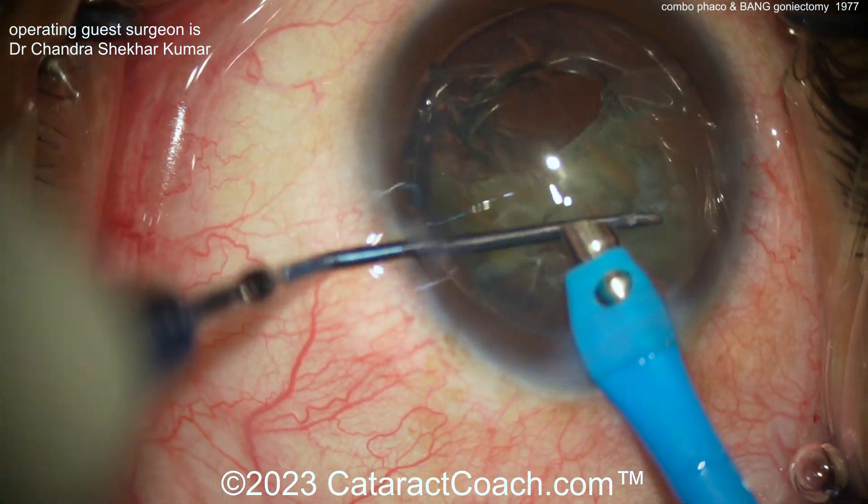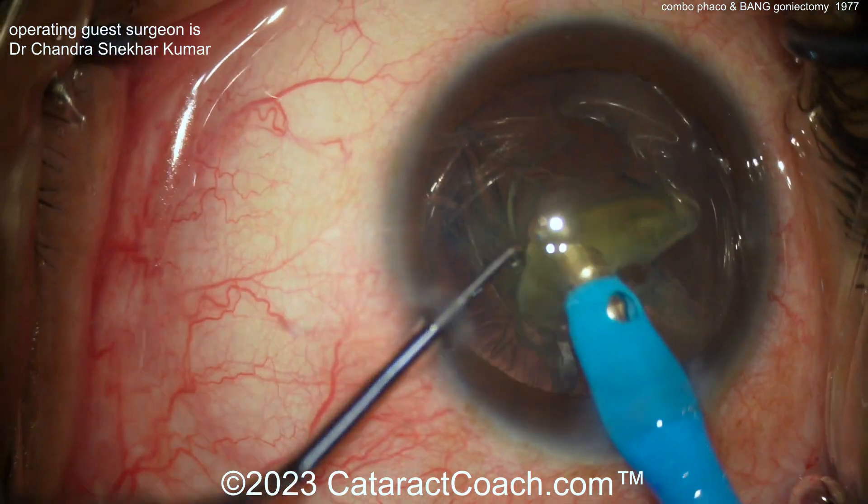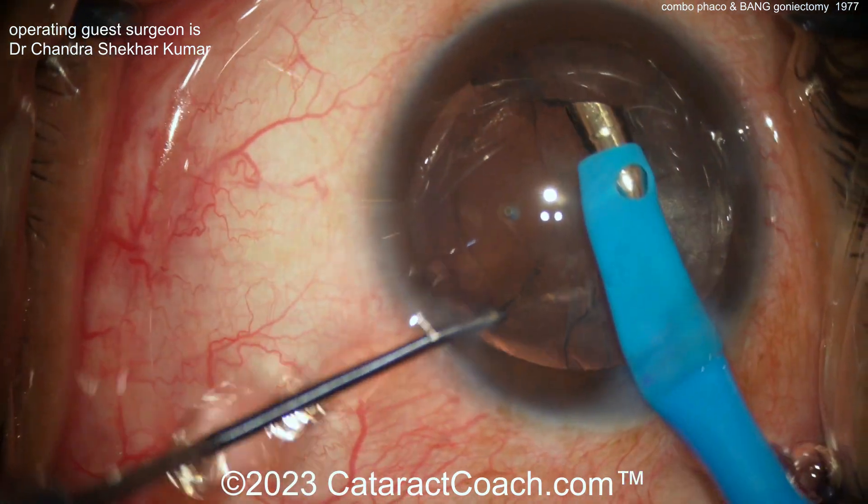Really nice chop technique here — getting out the cataract in a very efficient manner and then using that chopper to feed the pieces in. We've obviously sped up the video here; we'll slow it down for the BANG part.